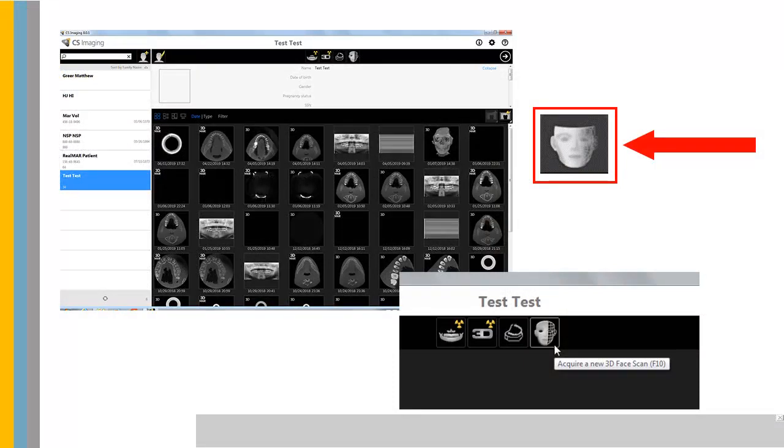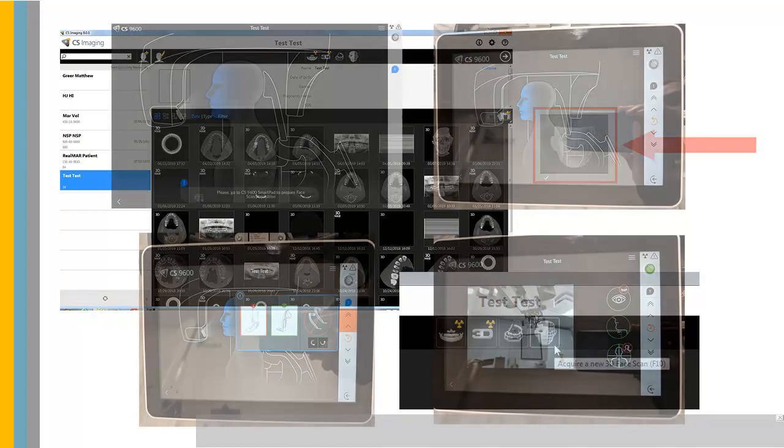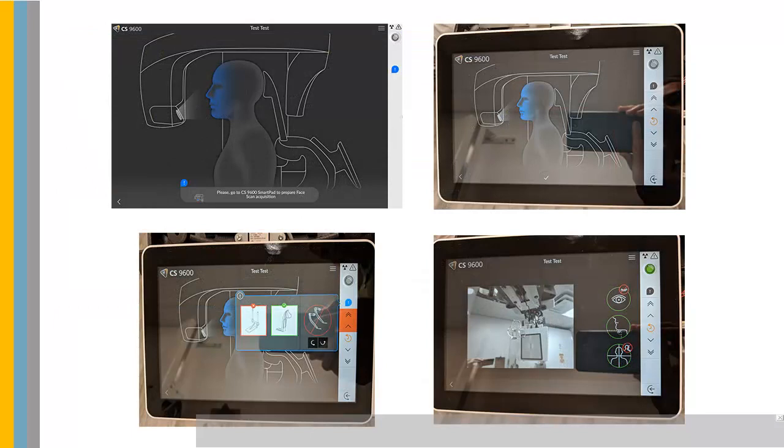On the main toolbar of the CS Imaging window or the Image Acquisition window, click the Acquire Facial Scan button. The 3D Facial Scanner Acquisition interface is displayed.